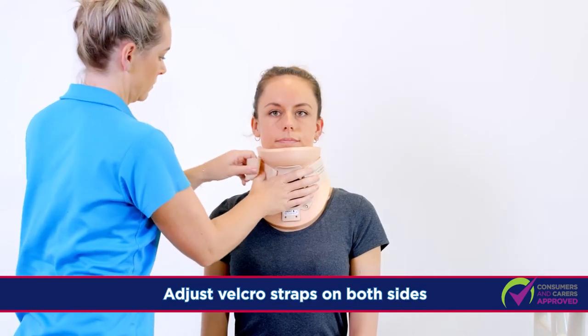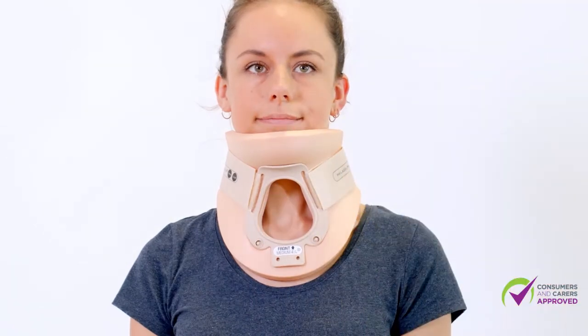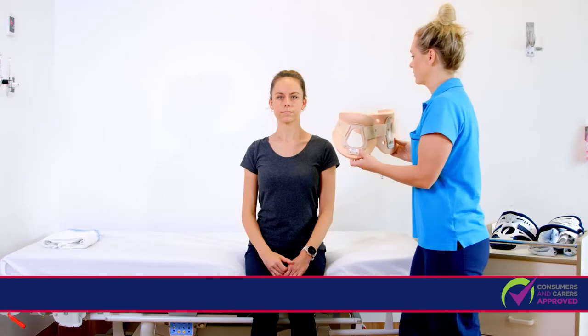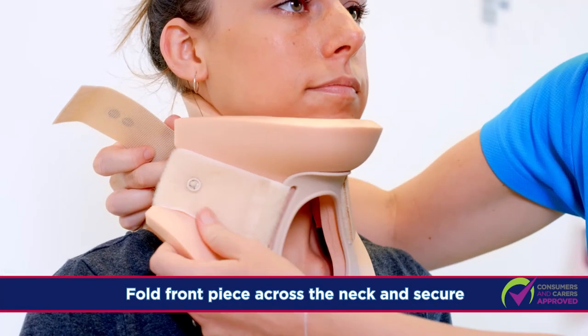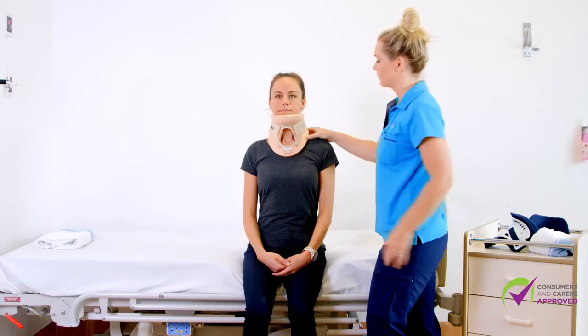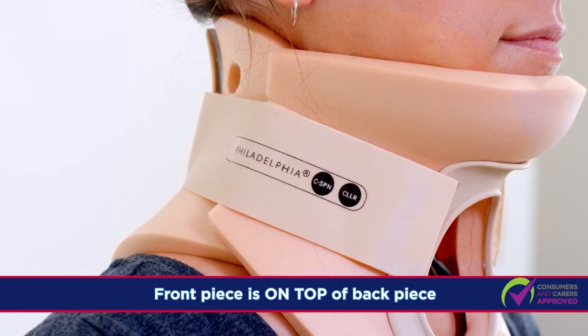Adjust the Velcro on both sides as needed. If the collar pieces are still attached on one side, place the back piece on the centre of the neck, fold the front piece across, and secure with Velcro straps.